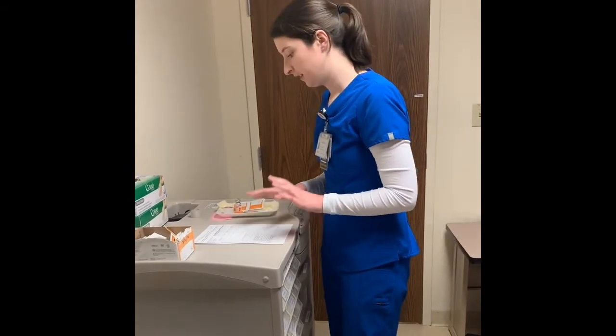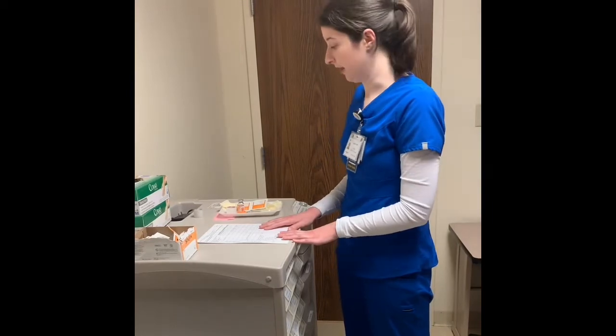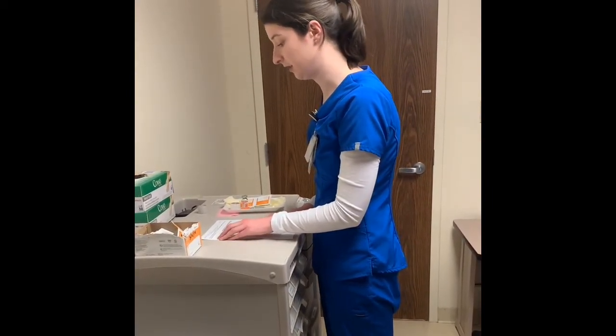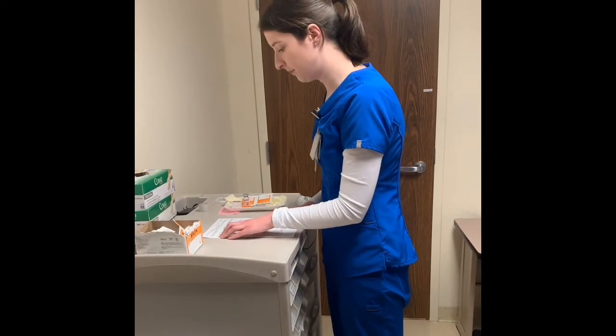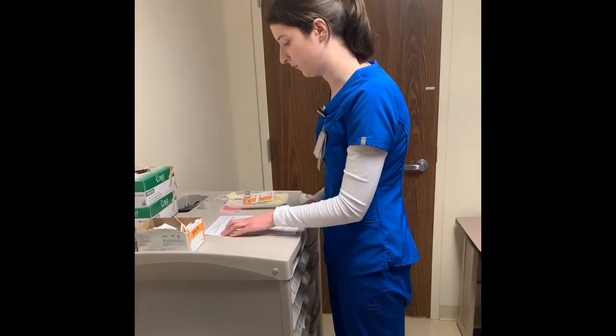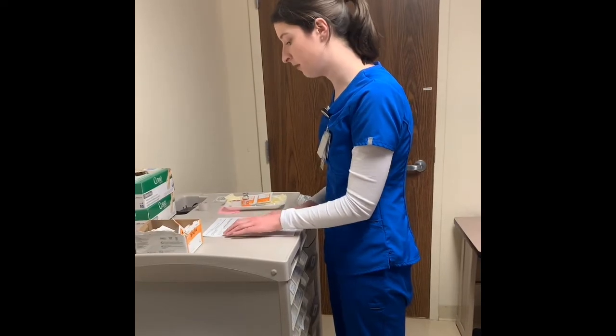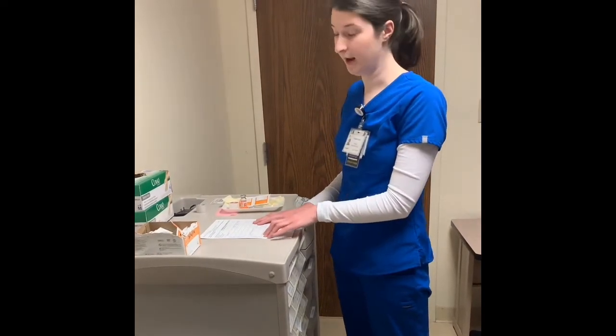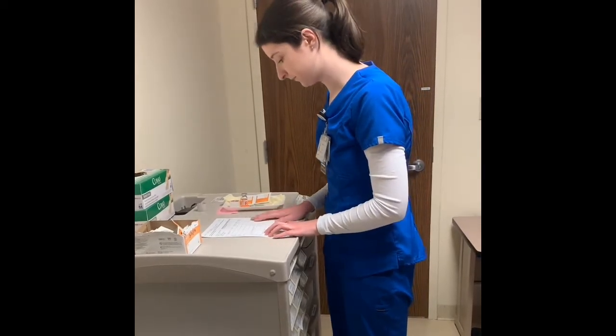Okay, now I'm going to go ahead and complete my first med check. So my patient's name is Carmen Guadalupe, date of birth is 2/2/92, patient ID is 535451130. He is allergic to morphine. We are giving regular insulin, so that does not interfere with this allergy.